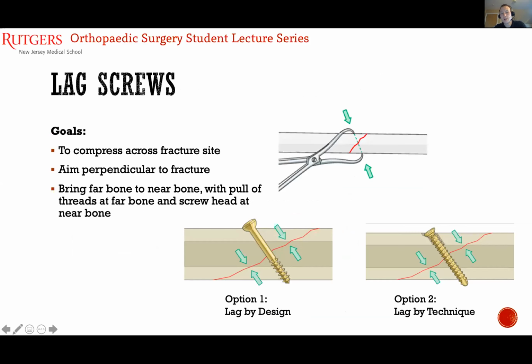In the first situation, if you're doing this in diaphyseal bone, meaning it's basically one hard cortex, then an open hollow tube, then another hard cortex, you're just going to pop the first cortex with the larger drill, and that's it. And then you drill the far cortex with the small drill. However, if you are in metaphyseal bone, you're not going to have that hollow tube in the middle. So there's bone all around you, and you do have to drill right up to the fracture site. And typically we do that using fluoroscopy. We can see where the fracture is on x-ray, and then using fluoro, we can guide the drill bit up to, but not beyond, the fracture.